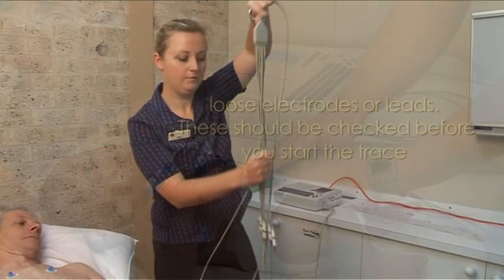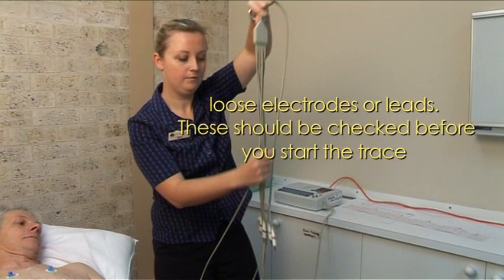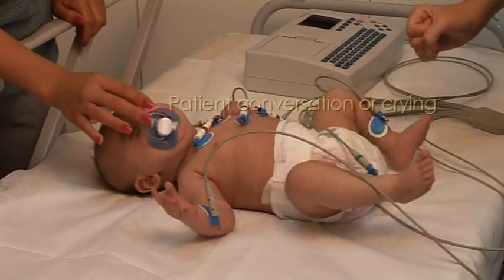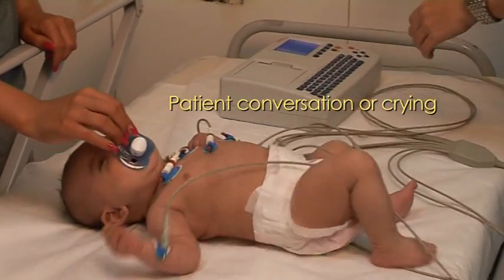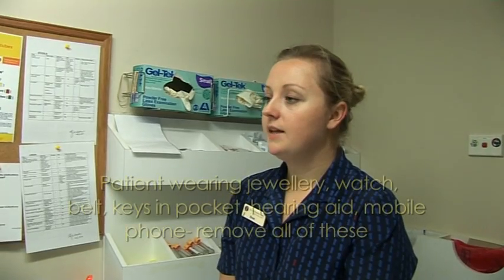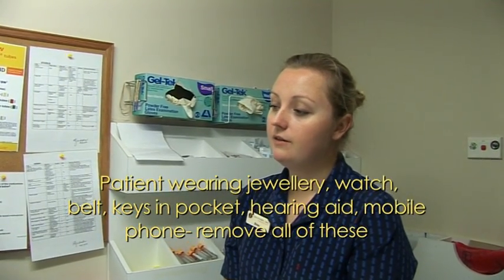Skin preparation is vitally important. Poor skin preparation and electrode contact will result in a poor tracing. Hairy skin must be shaved. Before we get started, I'll need to get you to remove everything heavy from your pockets.